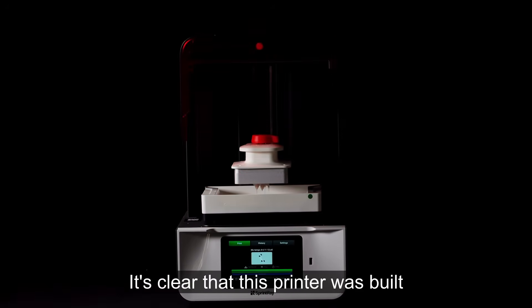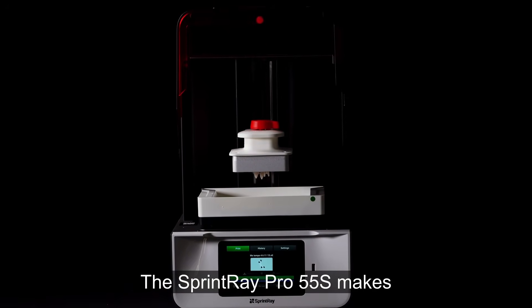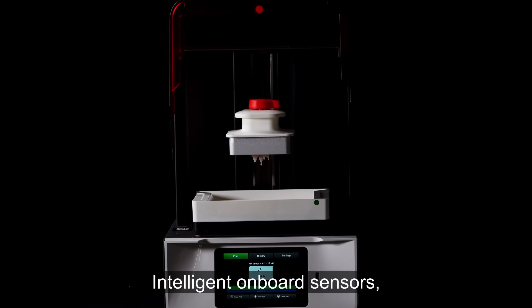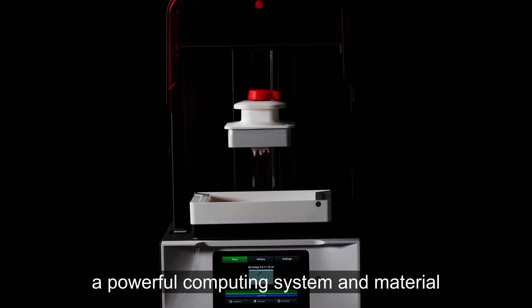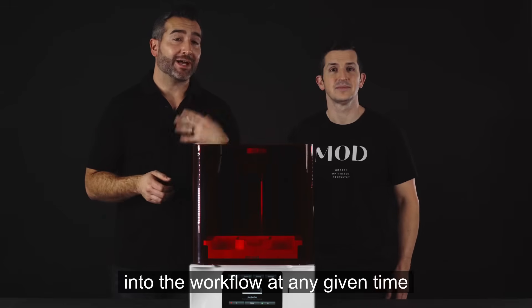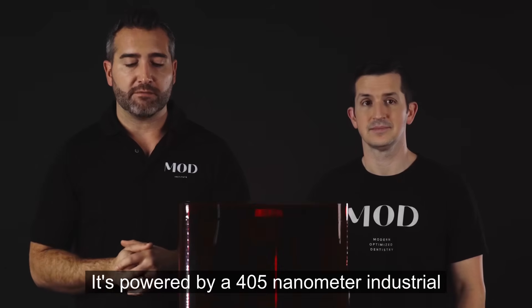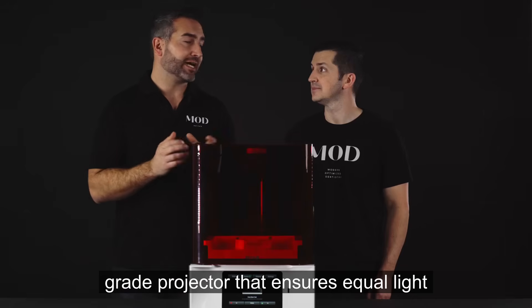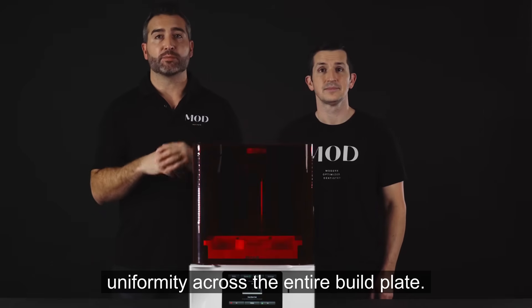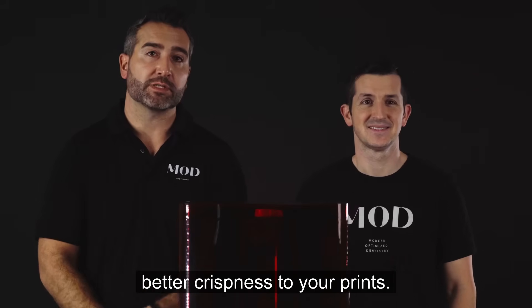It's clear that this printer was built from the ground up to be a dental printer. The Sprintray Pro 55S makes it really easy to 3D print. Intelligent onboard sensors, a powerful computing system, and material tracking means you can plug anybody into the workflow at any given time and they can successfully 3D print. It's powered by a 405 nanometer industrial grade projector that ensures equal light uniformity across the entire build plate, which means more successful prints and better crispness.